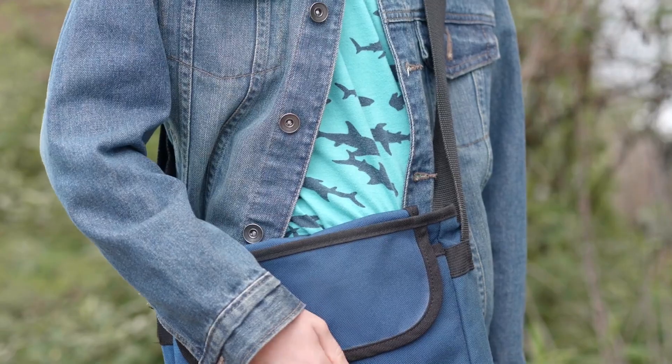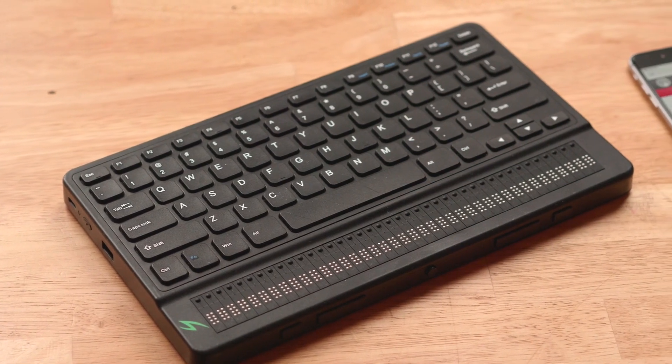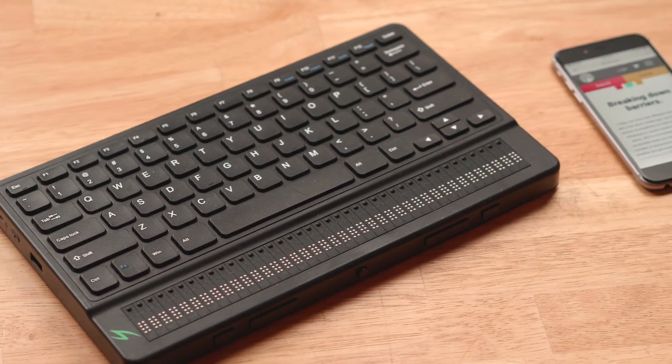The Mantis is an all-in-one QWERTY keyboard with a 40-cell Braille display just below it at the bottom. This device can go with you from device to device, whether you're using a Windows laptop, a Mac, or an iOS device. It's one keyboard that always has Braille right with it, and can connect to any device you're looking to connect to. Visit APH.org to place your order today.